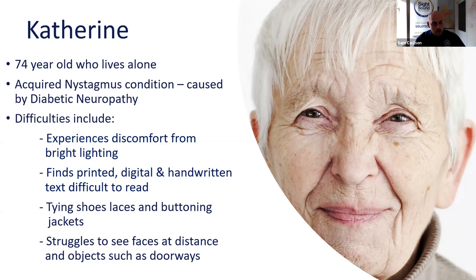Now, the difficulties that Catherine encounters include the discomfort from bright lighting. She struggles with printed, digital and handwritten text. That's important, and why I've broken those up, because as you'll see in a second, some of the products can deal with certain formats of text better than others. So it's important to bear that in mind: printed, digital and handwritten text.